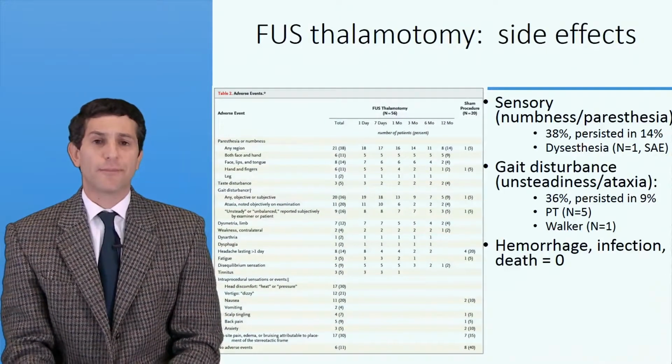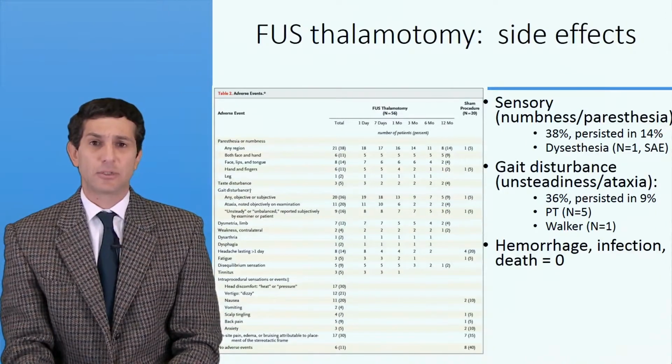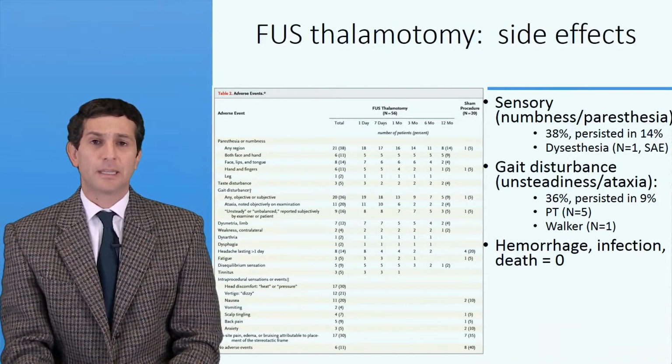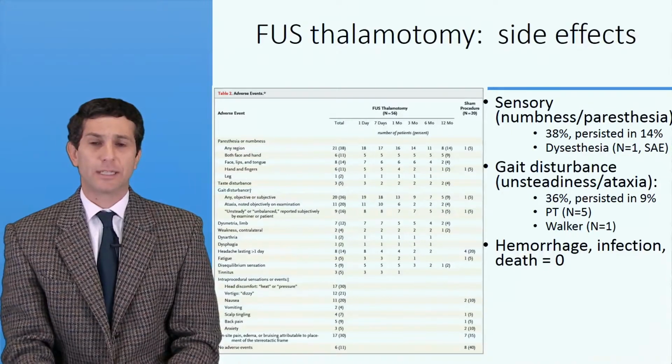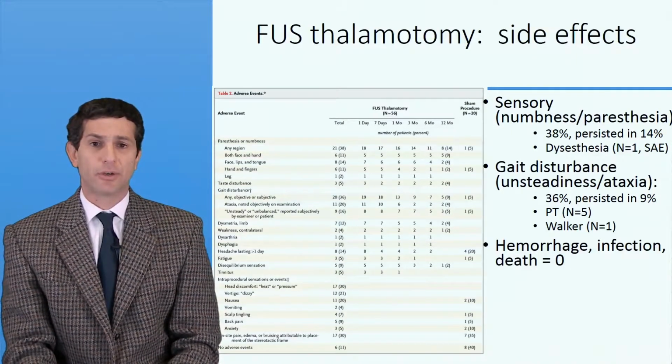And so it's important with every procedure to carefully characterize any potential side effects that can occur. This was a clinical trial conducted in 76 patients. It was FDA monitored, and so we really captured every type of adverse event, whether it was related or unrelated to the procedure. And we've listed these in our manuscript in the New England Journal.